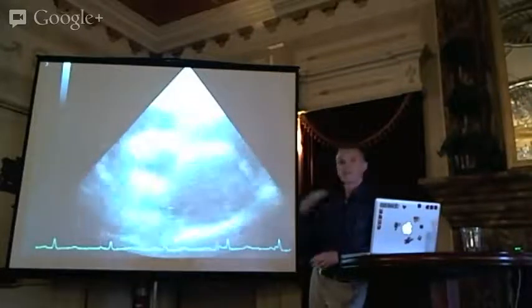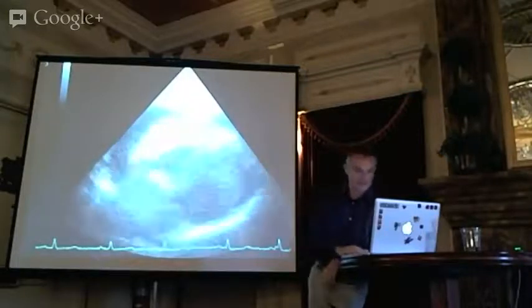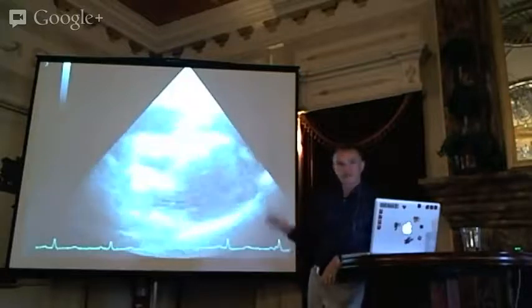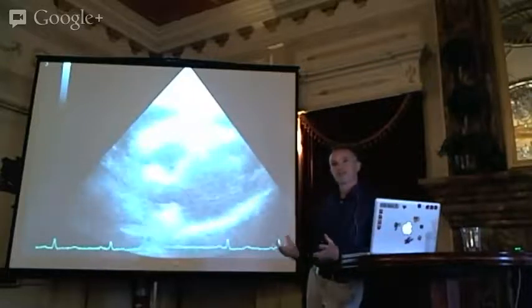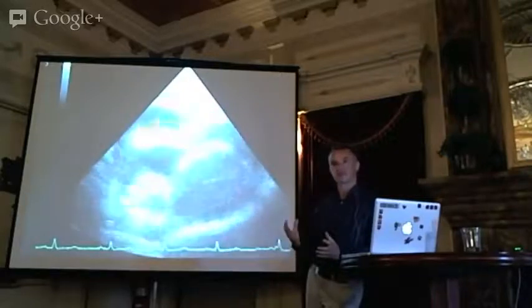Got fluid around the heart, with thrombus in that space. So he's got pericardial effusion in the context of shock, that's probably tamponade. He also has some features of tamponade physiology. Now, when you've got tamponade, you have a pressure in your pericardial space that exceeds the pressure in the right side of the heart during diastole.